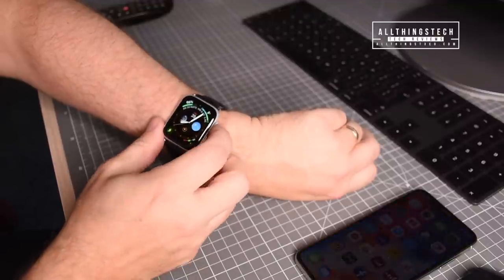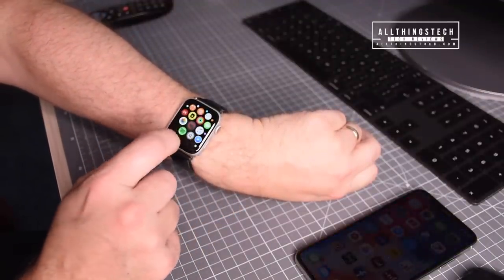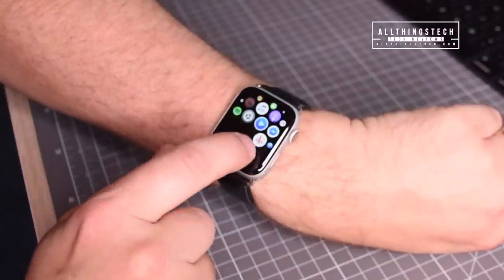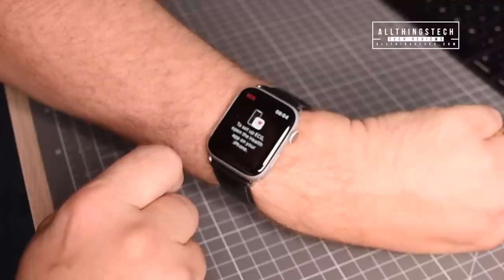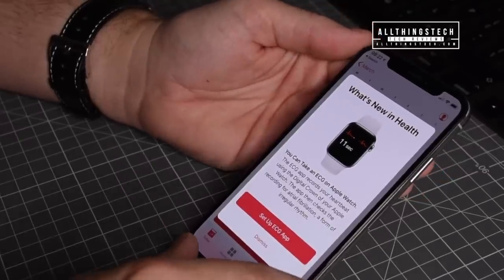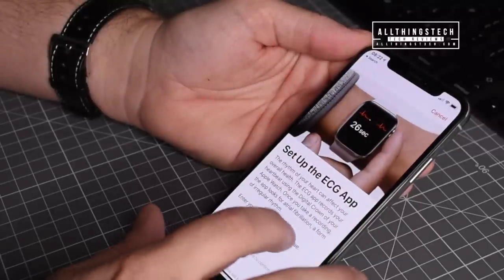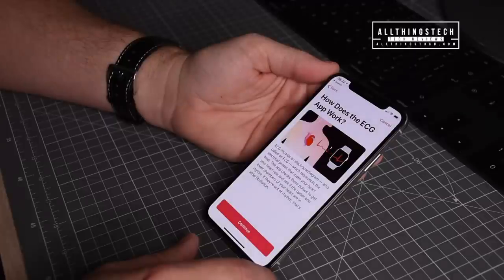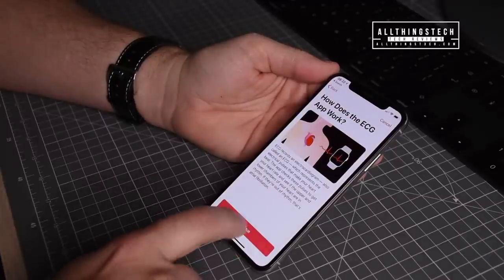Once it's installed, you'll notice a new ECG symbol in the apps on your watch. When you click on it for the first time, it will prompt you to set it up via the Health app on your iPhone. As soon as you go into the Health app, it will ask if you want to set up the ECG app, and you'll need to put in your date of birth.